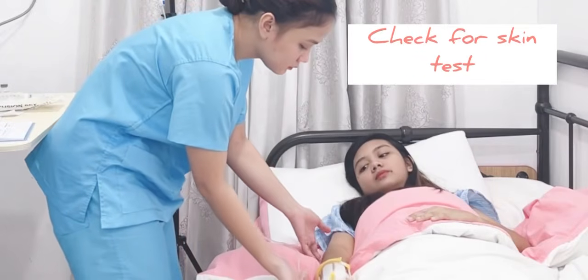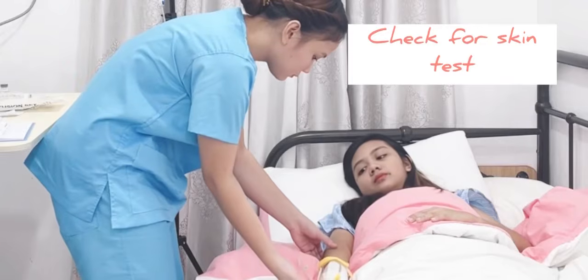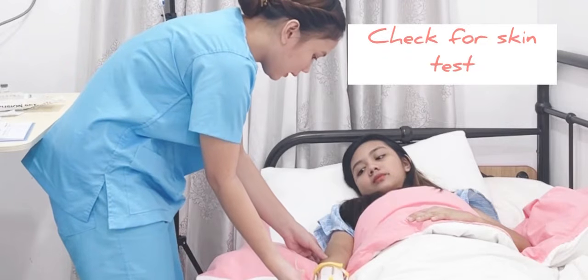Then check for skin test of drug or IV incorporation. It detects allergic response to medication.